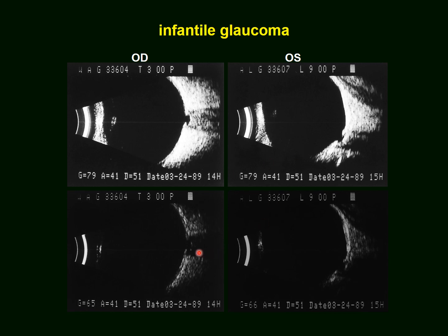Here we see reduced sensitivity settings, and the question is which settings are best for the diagnosis, the top ones or the low ones with the reduced gains. It's the bottom ones. They show more detail for the specific diagnosis, better display of the depth and the width of the excavation.